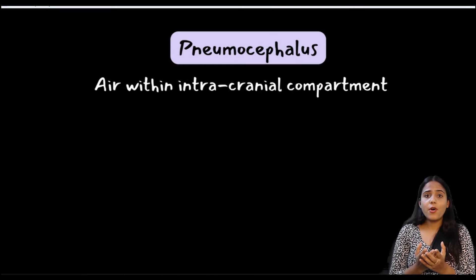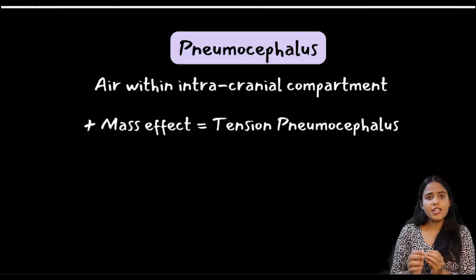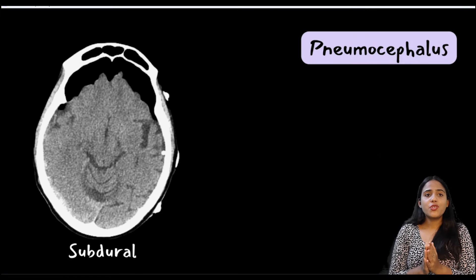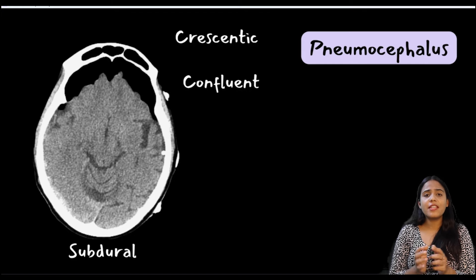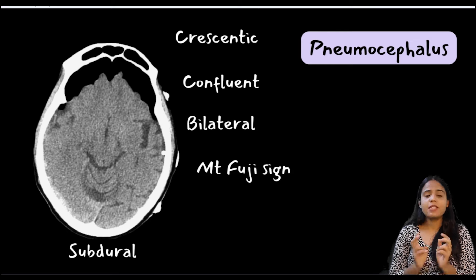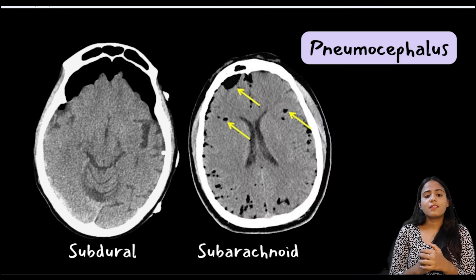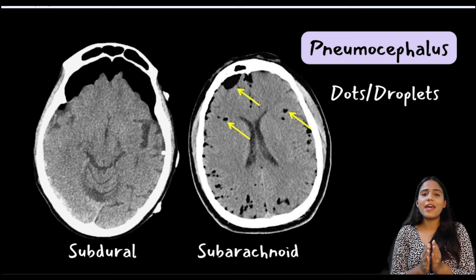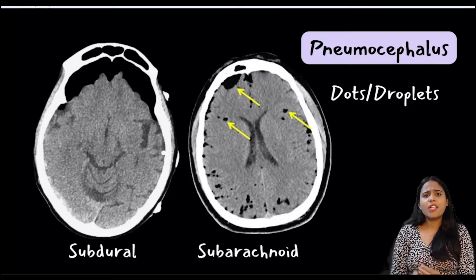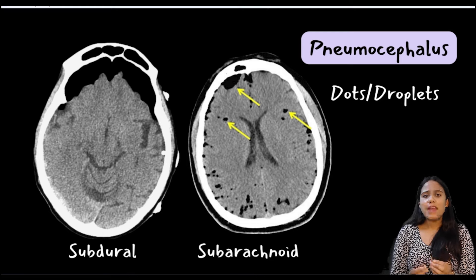Another important entity is the presence of air in the intracranial compartment, or pneumocephalus. When this produces mass effect and neurological deterioration, it is a tension pneumocephalus. The most common location is subdural pneumocephalus, which is crescentic, confluent, usually bilateral, and moves with change in patient position. The frontal lobes appear pointed — the famous Mount Fuji sign — and get compressed downwards, indicating tension pneumocephalus. The second most common location is subarachnoid pneumocephalus, where air is collected as dots and droplets in the cisterns and sulci. This must be differentiated from fat, as a ruptured dermoid cyst can show similar findings.